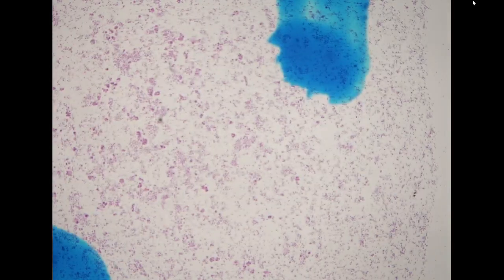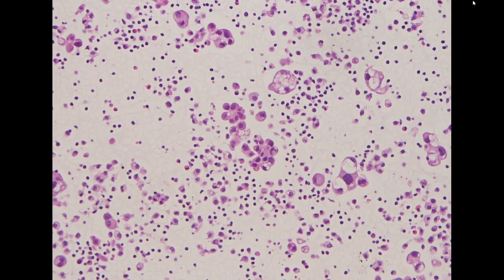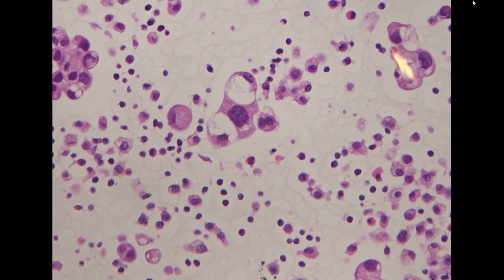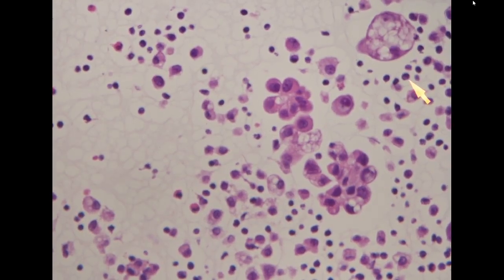So we do have a cell block. In the cell block, I just want to show it and compare with the previous case. Indeed, for this specimen, there are some really big clusters, some atypical cells with bubbly cytoplasm, but again, this doesn't look like small cell, right? If it is carcinoma, it is non-small cell, likely adenocarcinoma.